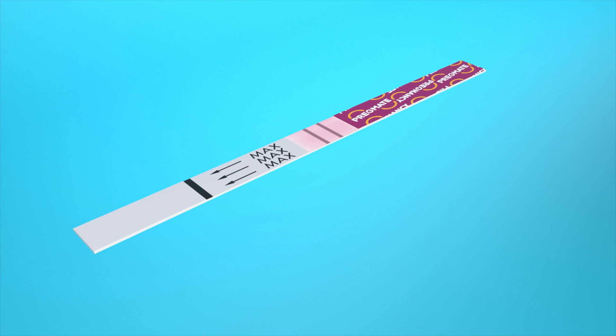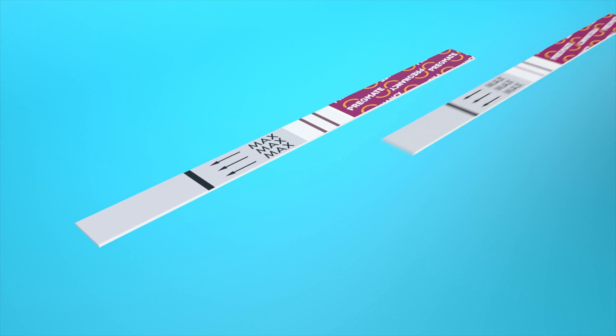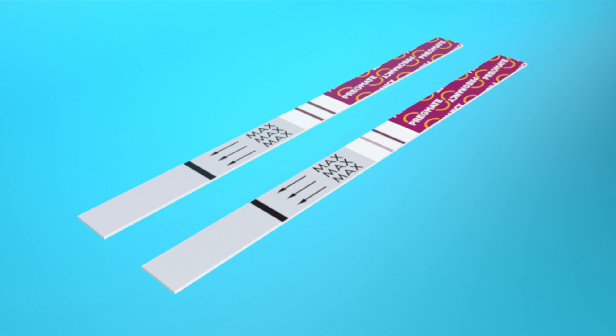If you get a positive result with just two lines, you are pregnant. This is true no matter how faint the test line is.